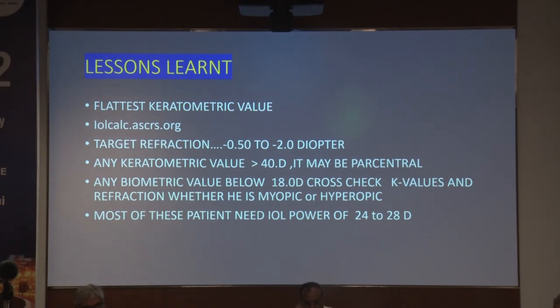If the biometric IOL power you are getting is less than 18, and the patient is not myopic, if the patient is hyperopic, probably you are wrong. Most of these patients need IOL power around 24 to 28. So if the IOL power is coming less than that, you have got to be very, very careful.